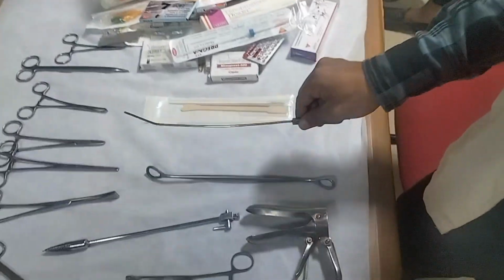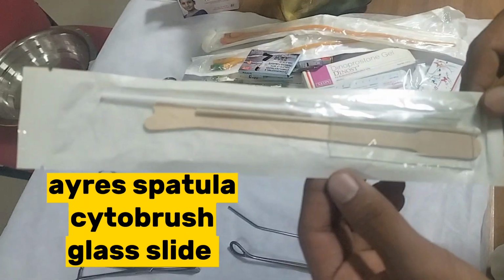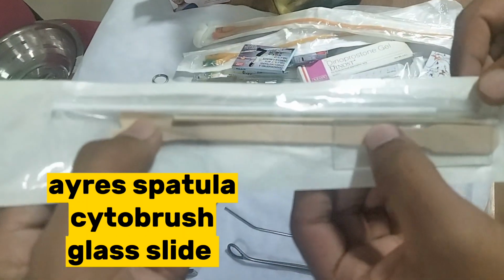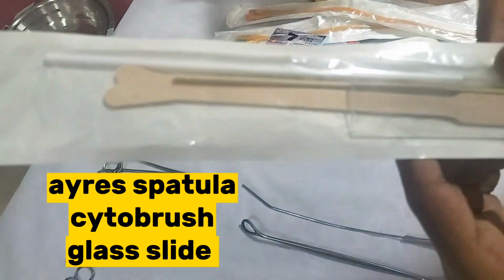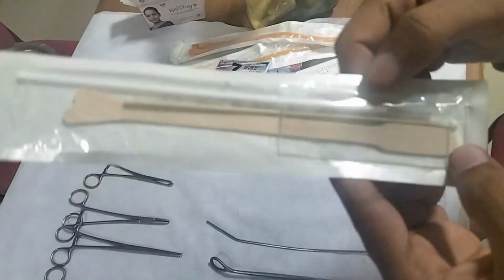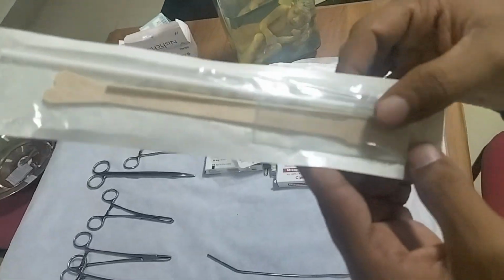Okay. Next. This you can see, this is instruments required for a pap smear. The wooden type you can see, this is the Ayre spatula, used to take an ectocervix specimen. Next one more thing is a cytobrush. Here you can see this is a cytobrush used to take the endocervix sample. And glass slide is there for mounting for the pap smear.